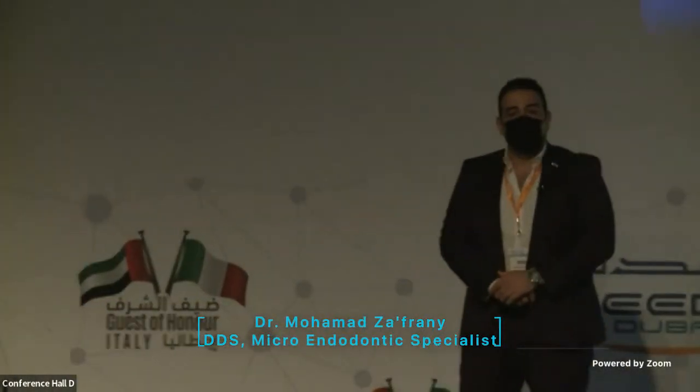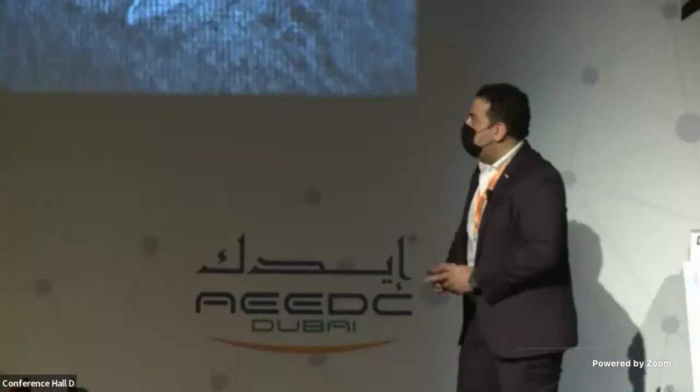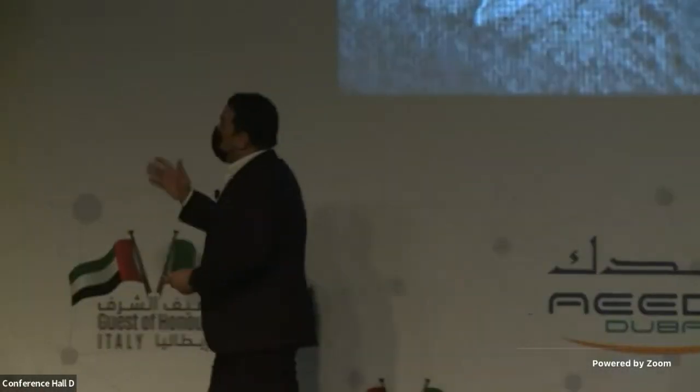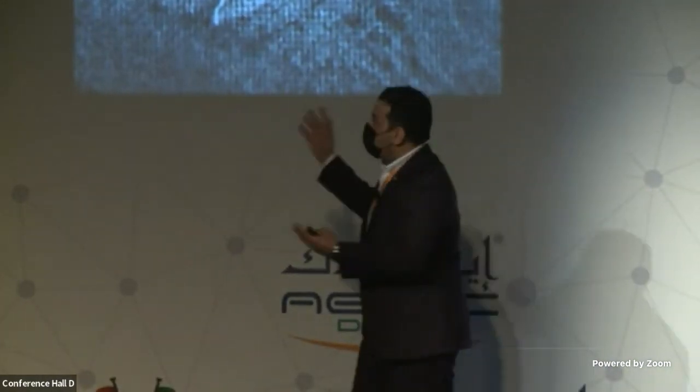Different day, speaking about the topic of management of retreatment difficulties. So I think most of us are familiar with this kind of radiograph, seeing these periapical radiolucencies below roots of ill-treated or poorly treated tooth. And after good treatment, we can notice the absence of radiolucency. So we can notice the difference between the failure and the success.